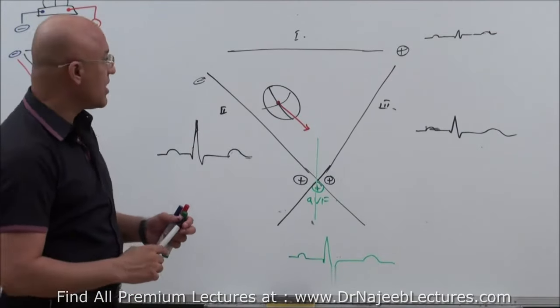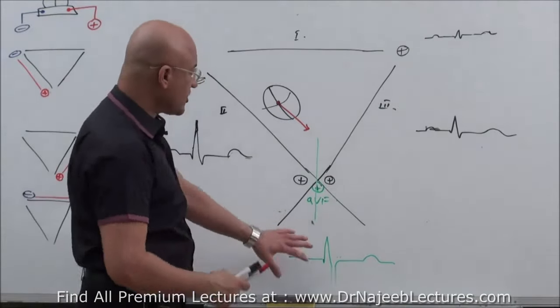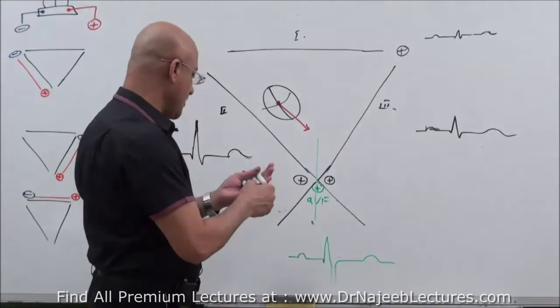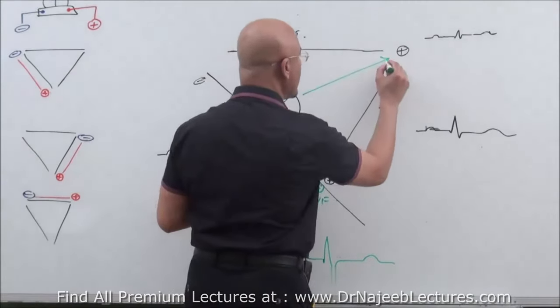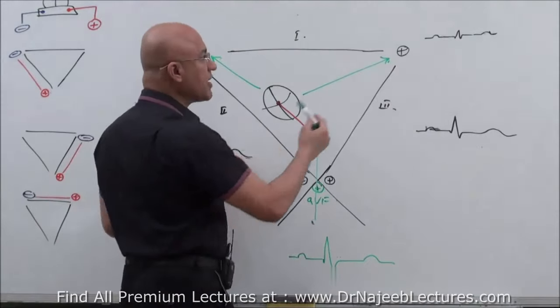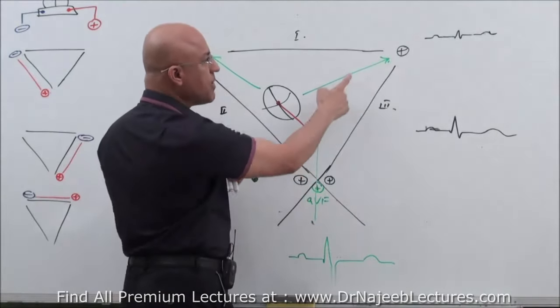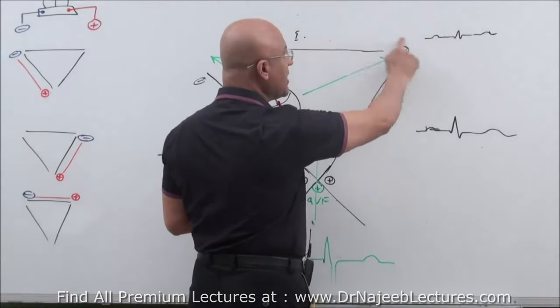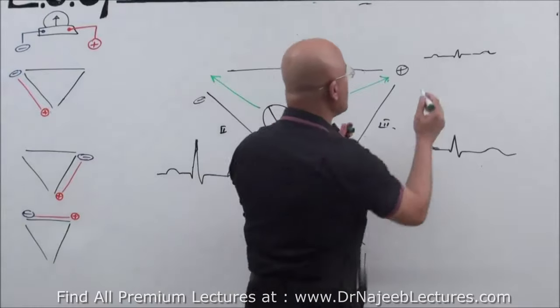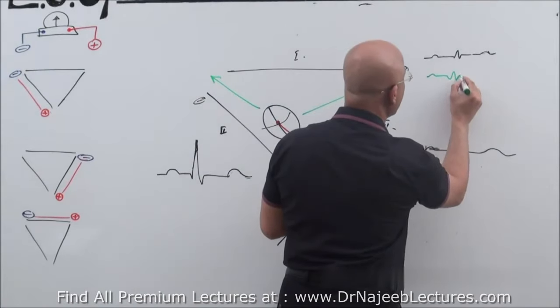Yes. Right? Another thing. This is the pattern of AVF. What will be the pattern of AVL? AVL is like that. Is that right? And AVR is like that. What will be the pattern of this? It will be somewhat like lead number 1. So it is almost the same as 1.